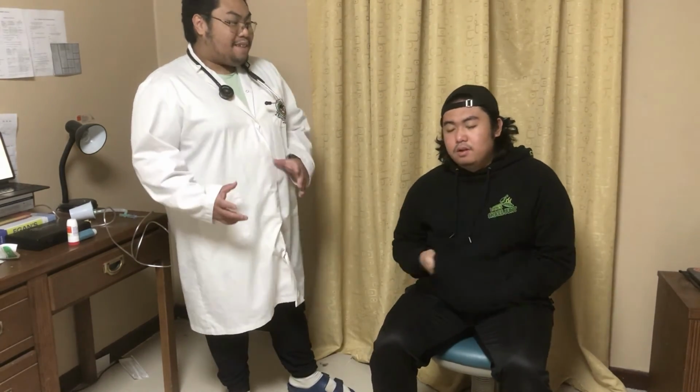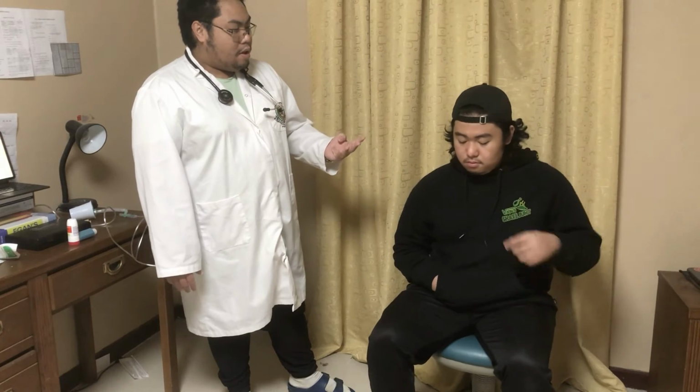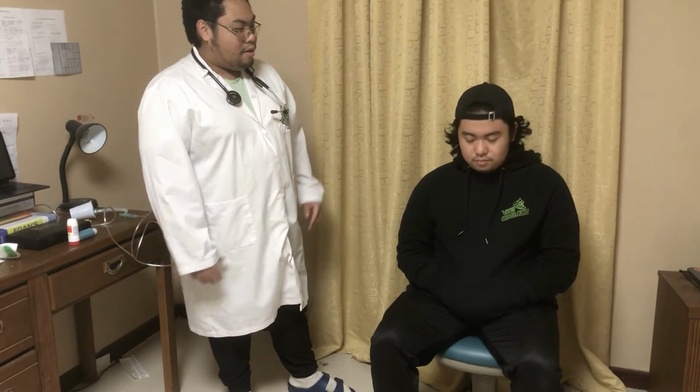Now, we're going to consult our patient first before starting out for them to be more comfortable and to practice. So sir, we're going to be performing the last test now. It's a little bit difficult, but we can do this together. It's called the MVV, where you get, as usual, 3 normal breaths. But then now for 10 seconds to 15 seconds, you're going to be breathing in and out, as deep as you can, and also as fast as you can. Can you do that? Okay, so first, let's practice.